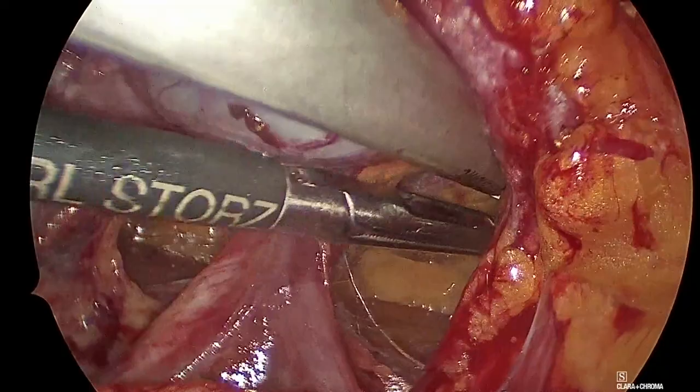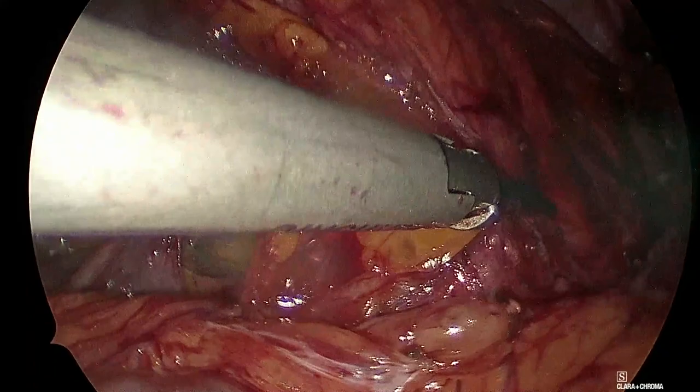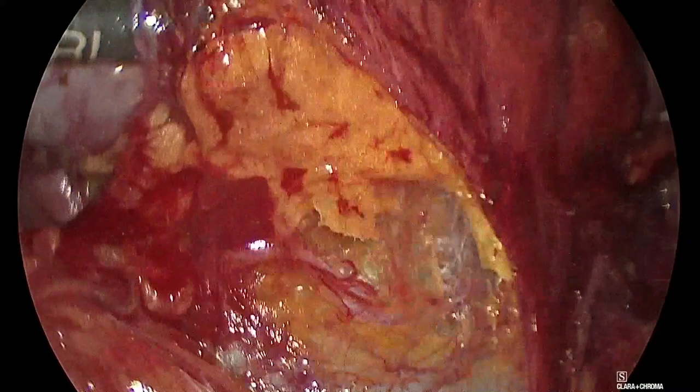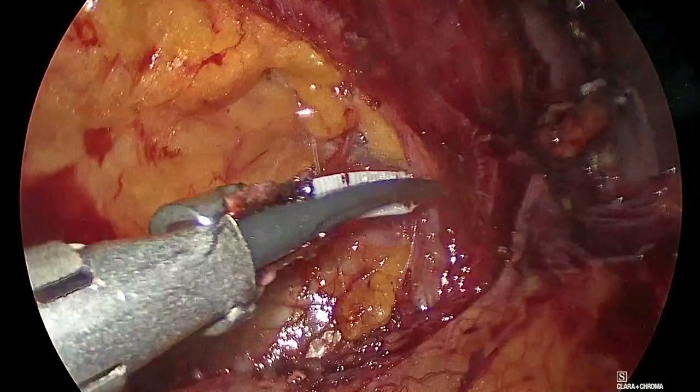Okay, let's see. Go here. Let me see here. So you see the fact that the upper pole is already dissected, it gives me a lot. Ponme, por favor. No, ves, ahora tienes que ir a las 12. Vale. Okay, so the IVC is here. You see the IVC there. So now it's just a matter of little by little. See, the main renal vein is here. I think you see it, right? That's the main renal vein. Yes, we do.